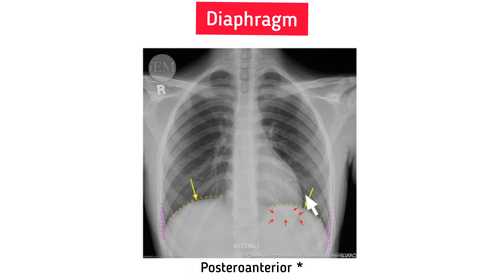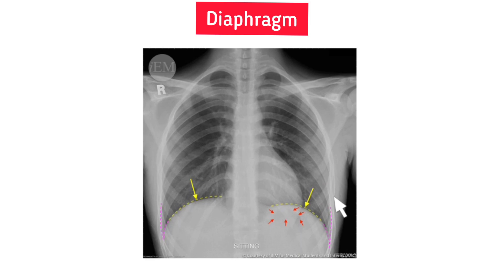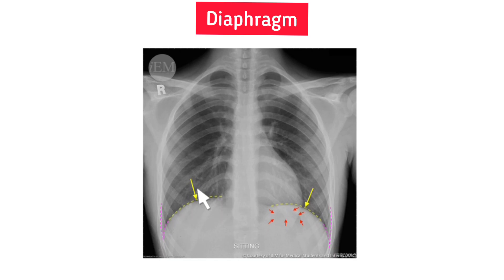Next, the diaphragm. Yellow dashed lines represent the diaphragm, red arrows the gastric air bubble, and pink dashed lines the costophrenic angles. The outline of the diaphragm should be clear and smooth; the right hemidiaphragm should be higher than the left. Three major characteristics: first, the gastric air bubble on the left; second, the diaphragmatic contour looks dome-shaped with the right side slightly higher; third, the costophrenic angles, which should be pointed, sharp, and clear.